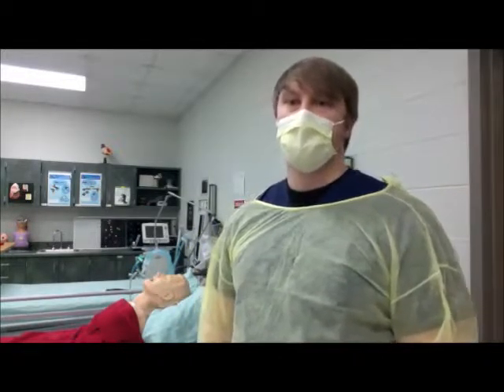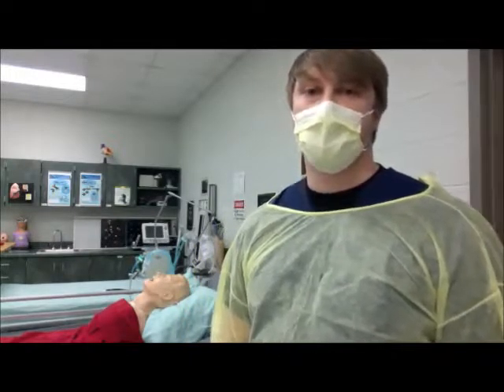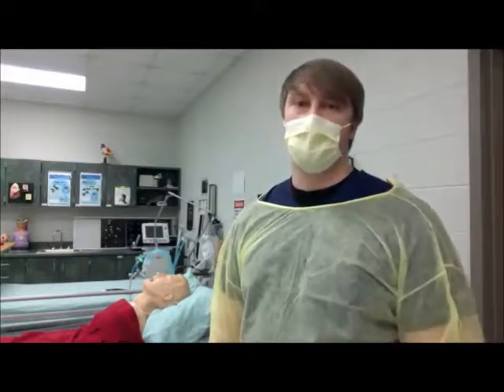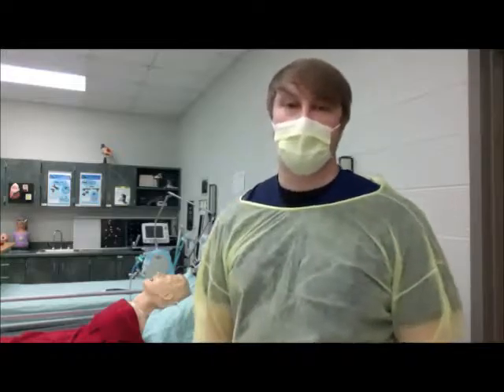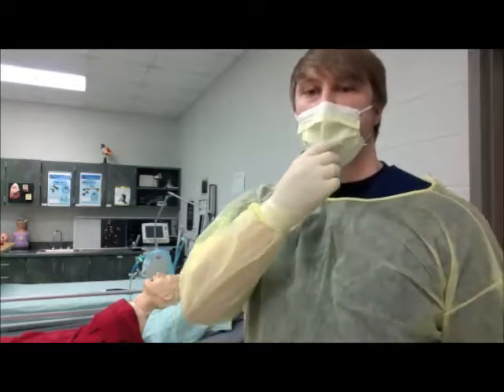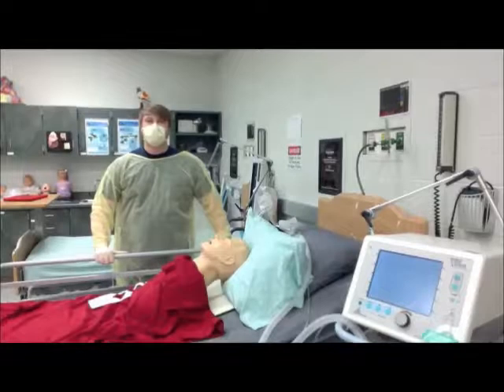So I've obtained an ABG and can almost already predict that her ABG result is going to be an acute alveolar hyperventilation superimposed on chronic vent failure. So in this case, her pH is going to be increased, her CO2 is going to be increased, and her bicarb is going to be increased, but her PaO2 is going to be decreased. So everything's going to be increased except for her PaO2.